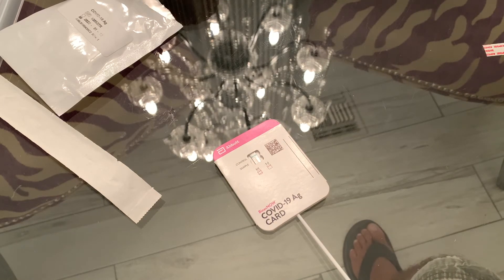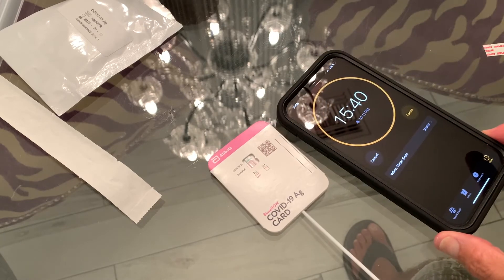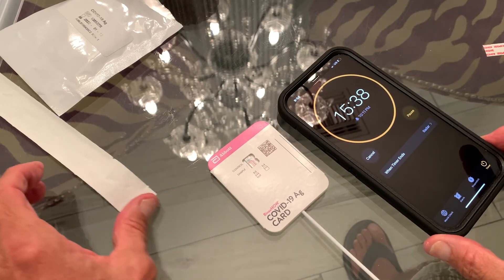As soon as we flip it over and push it down, we've got to start our timer and go 15 minutes. I set the timer for 15 minutes and 45 seconds. The directions say you have to go over 15 but not over 30 minutes, so make sure you're somewhere in between — at least 15 minutes before you look to see if you have results. Starting the timer now.